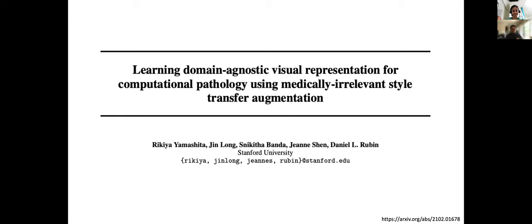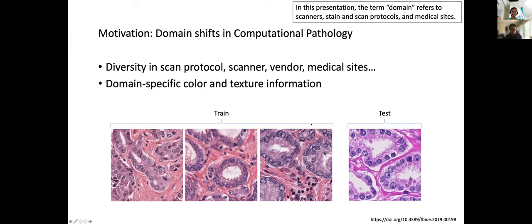Then let's move into the paper that I'm going to present today. As we've seen, the motivation for this study is the domain shift. In this presentation, I use the term domain to refer to a scanner, stain, scan protocols, vendor differences, or the medical sites, institutions. And as we've seen, these color or texture information on the slides are largely domain specific.